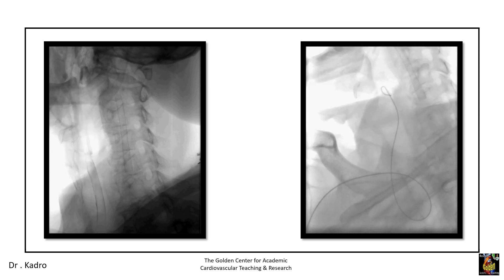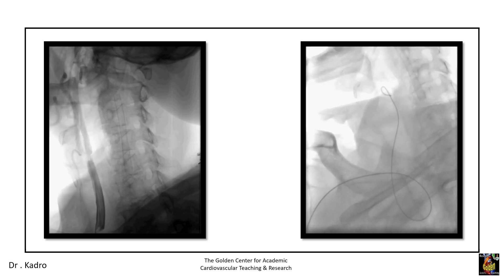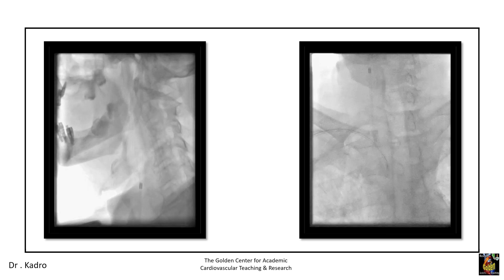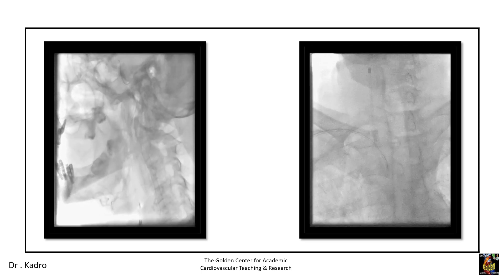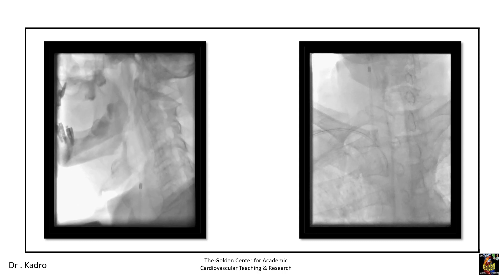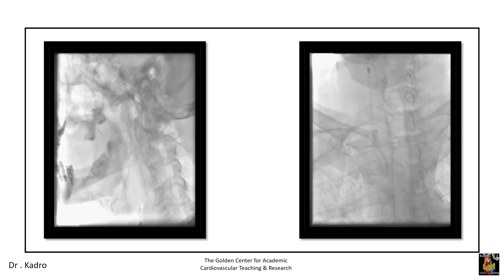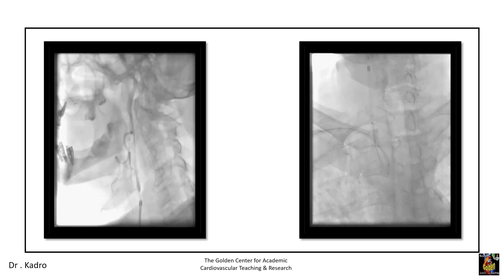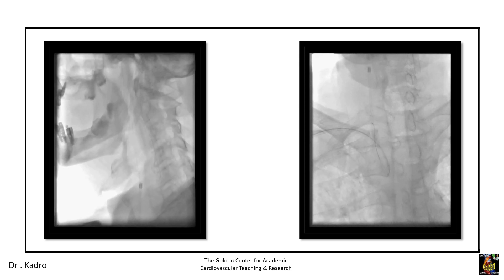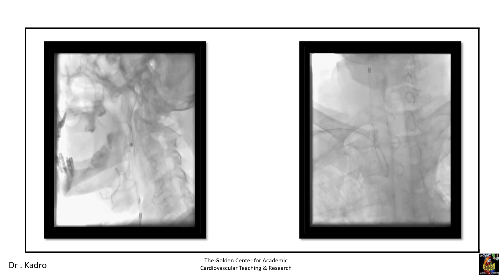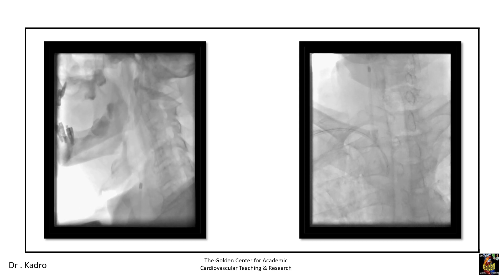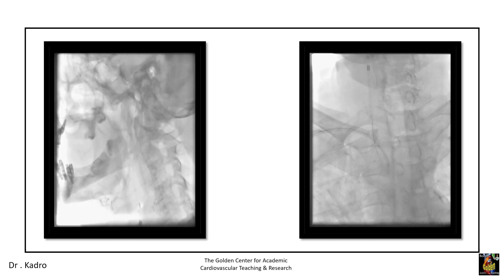A stiff wire was placed in the right common carotid after making a loop to engage the carotid. A six French sheath was then placed in the right common carotid. This is the angiogram showing the lesion, and this is the fluoroscopic image showing the position of the sheath with the loop.